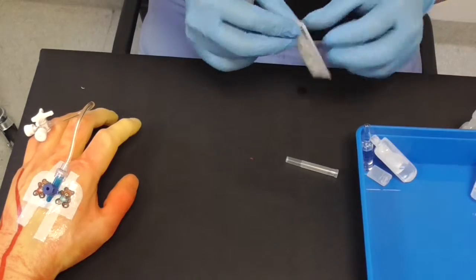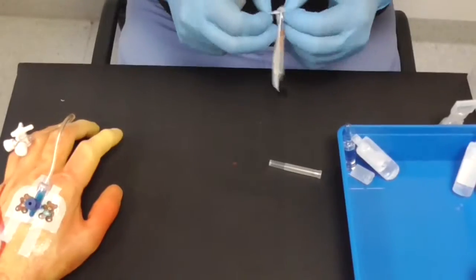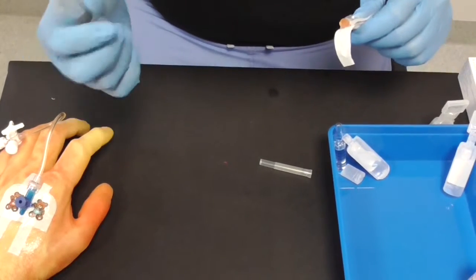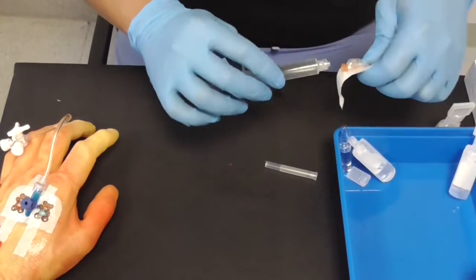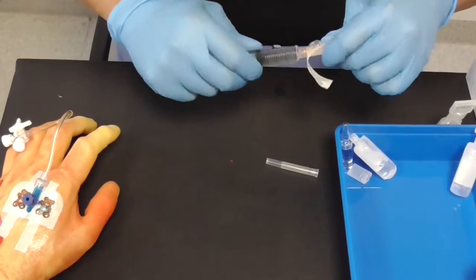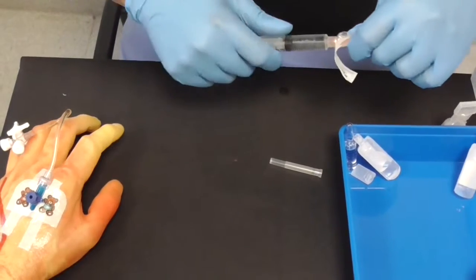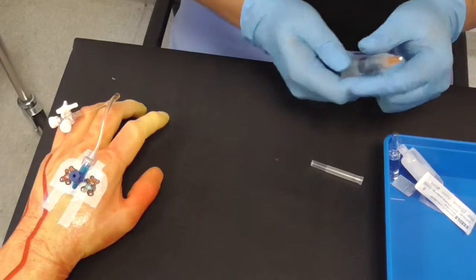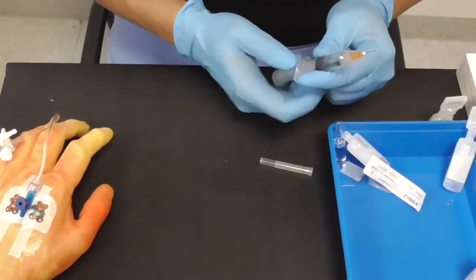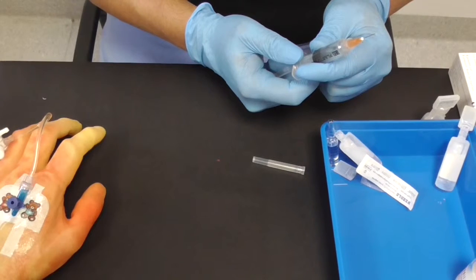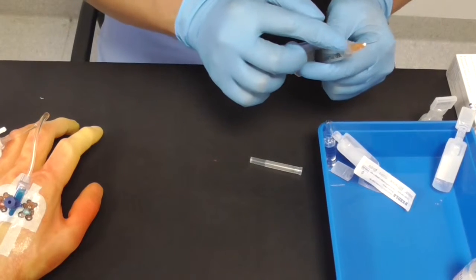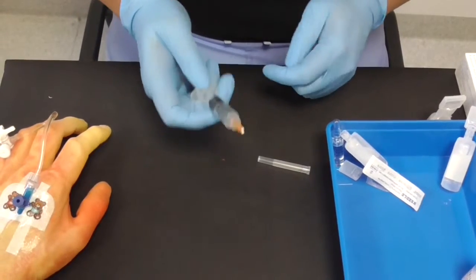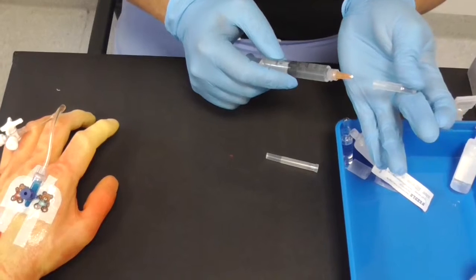In case you want to give, say, lignocaine for local anesthetic, you're going to use a needle. Let's pretend now that this is lignocaine and we've just drawn that up. You're going to use a needle instead of putting it intravenously into a patient. Say you're giving a ring block also. So needle is on safely, pull it out. Then you have to prime the needle because there's a bit of air in that needle. So you push that, you can see the fluid coming out, which means there is now that fluid medication, the lignocaine in this case, inside, and then you can go ahead and do it.